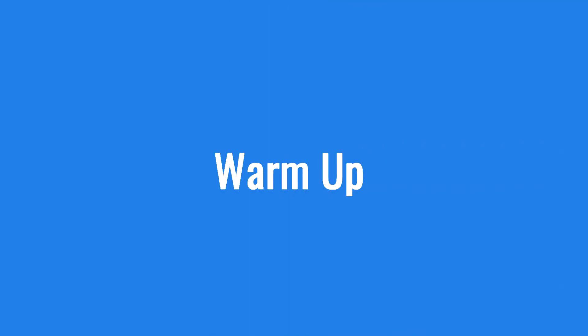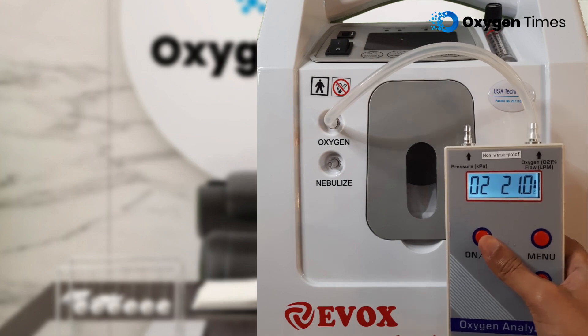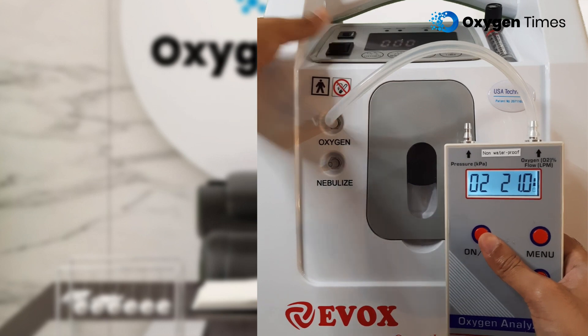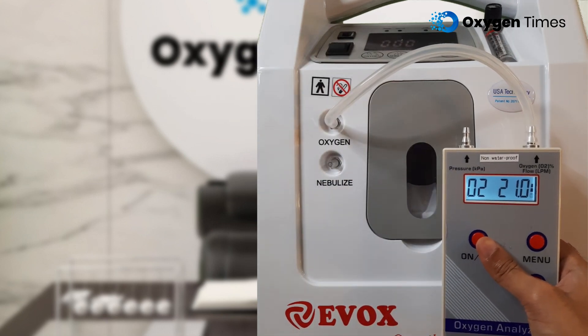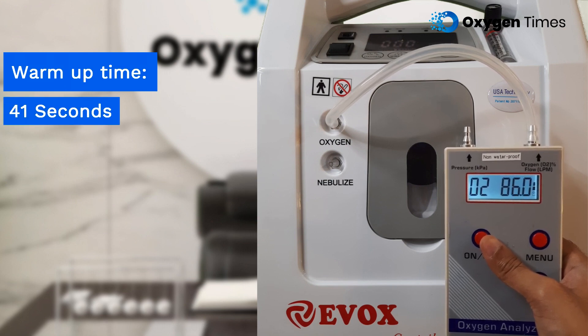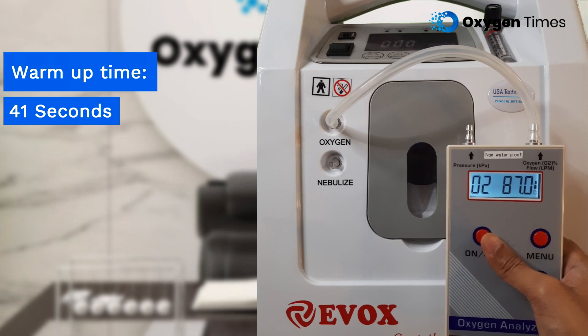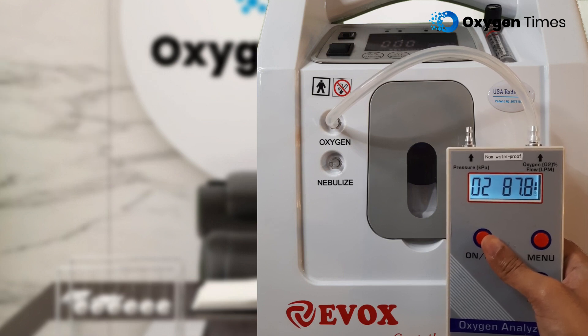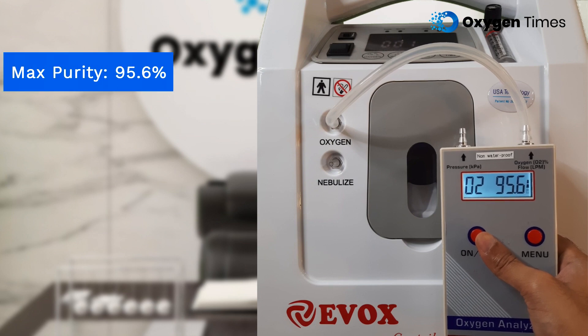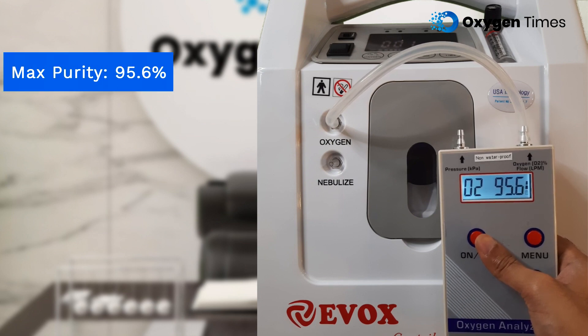Starting with the warm-up time this device takes to reach therapeutic levels of oxygen, we will switch on the oxygen concentrator first. In our warm-up test, we found that the oxygen concentrator took only 41 seconds to reach therapeutic levels of 86%, and 1 minute and 32 seconds to reach maximum purity of 95.6%. The results are highly appreciable and the warm-up time of 41 seconds is actually one of the best in the 5 LPM range.